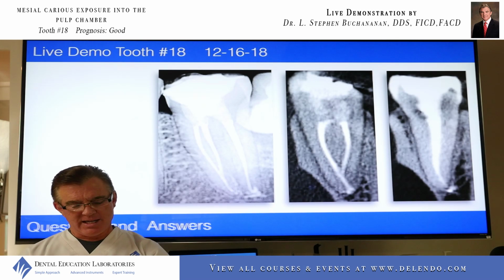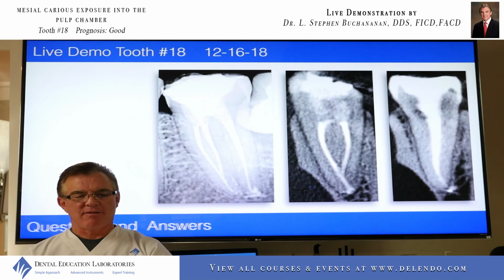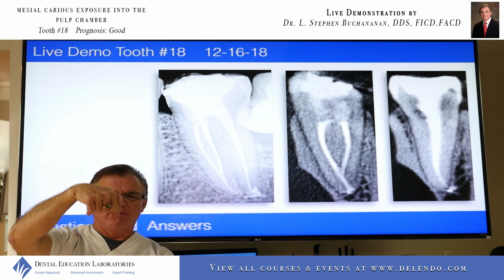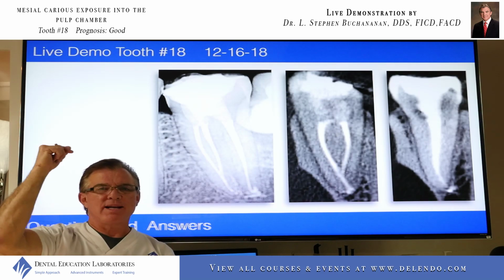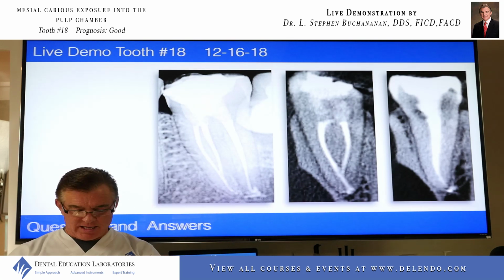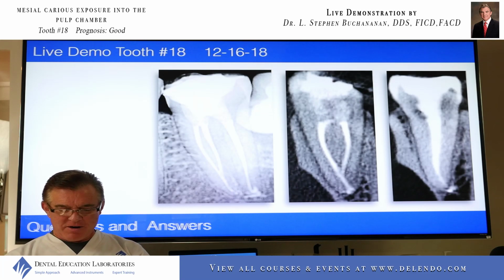When Ryan finishes making the platform and takes the platform former off the top of it, he usually uses a number 40 Hedstrom file, I think, in a rotary handpiece, and just runs it down through, then it winds up the sponge and pulls it out in one fell swoop, and then there's a lot less debris to cut around the edge. So that's a great technique. If this is your question, thank you, Ryan. If it isn't your question, thanks for the technique, Ryan.